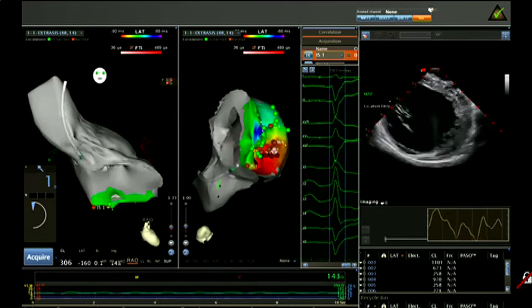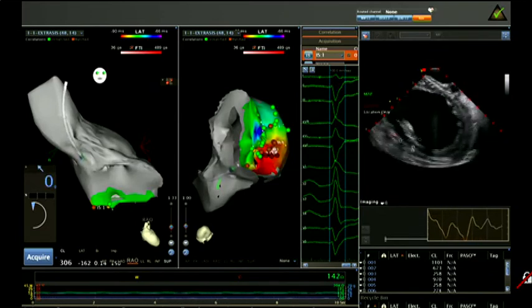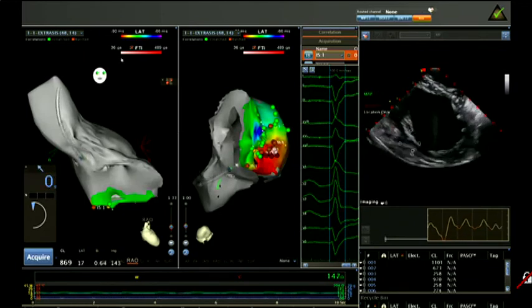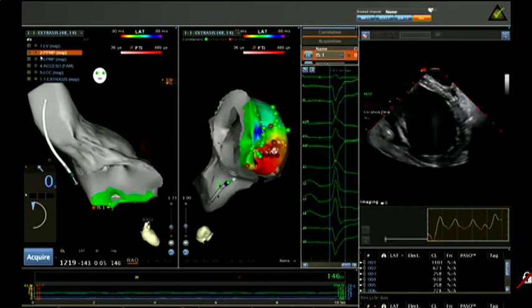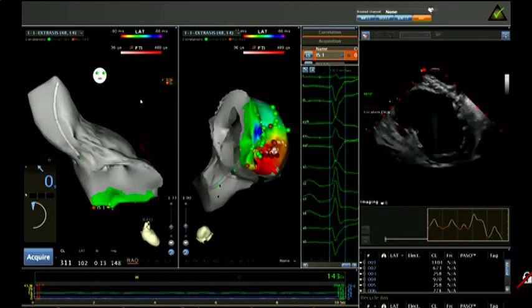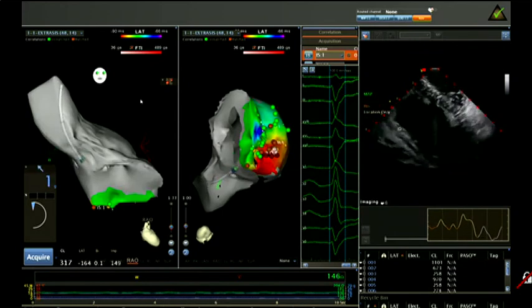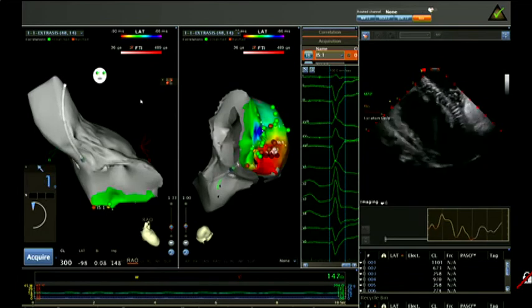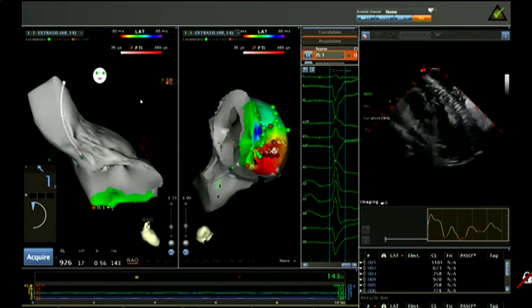Well, Hector, I didn't hear you properly, but initially it seems that you agree that the papillary in the MRI was enhanced with gadolinium, and there is also gadolinium in the inferior wall below the papillary muscle. So Miguel is going to describe the findings of the intracardiac ultrasound.